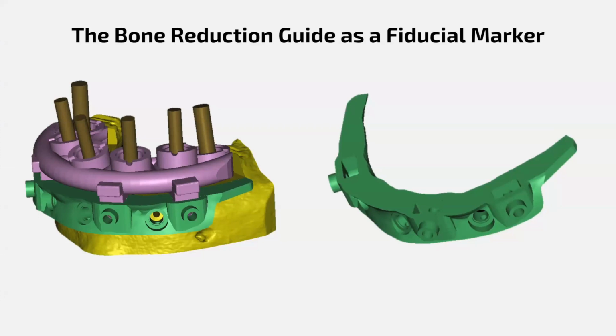But what's nice about doing things with guided surgery and having a bone reduction guide is you can actually use a bone reduction guide as a fiducial marker, especially if that bone reduction guide, like what ITX does, is they actually have you fixate it with a bone screw. That's going to give you a really nice fiducial marker that is going to be very stable and won't move during surgery and won't change during surgery. Bone reduction guides that are fixated with pins typically will move a little bit during surgery, so they aren't quite as good. They'll still work, but they aren't quite as good as a bone reduction guide that's fixated with screws.